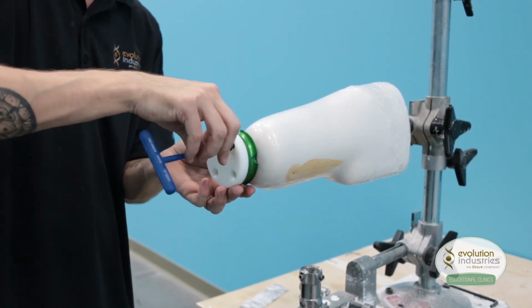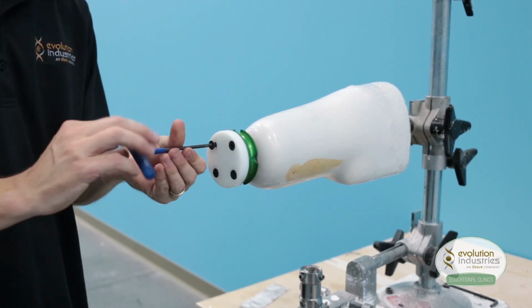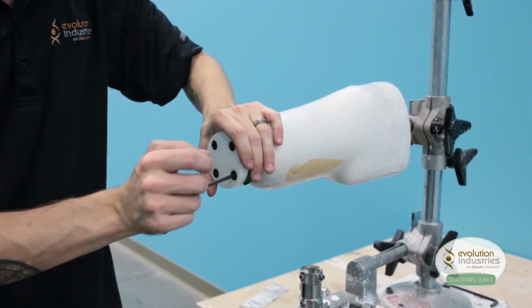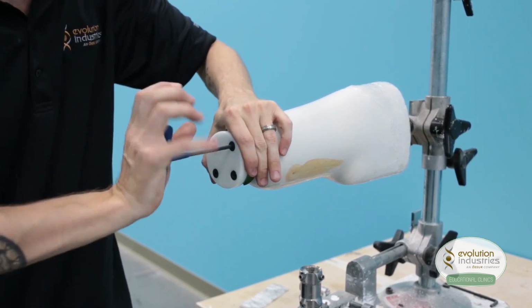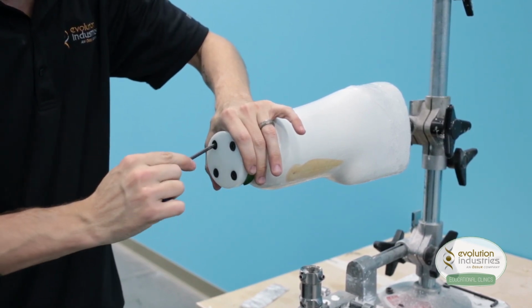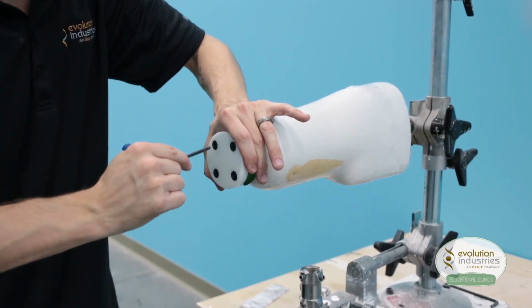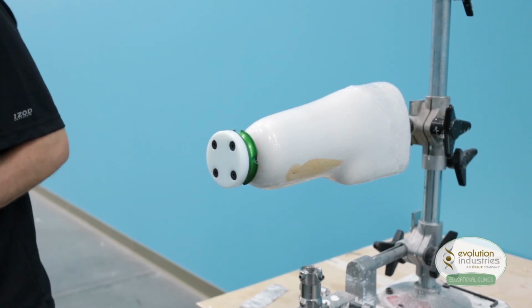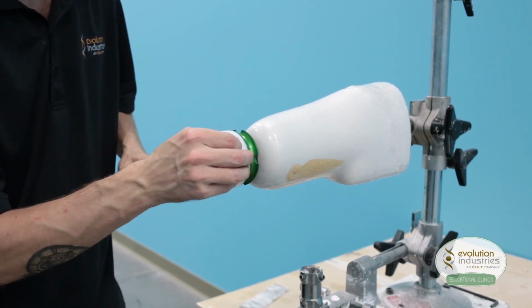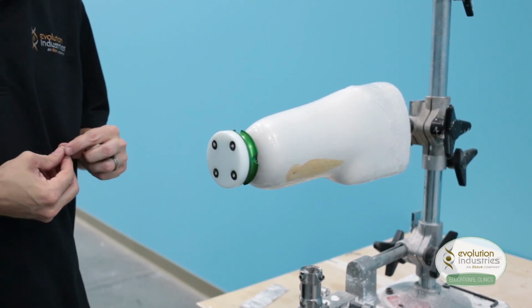With our lamination dummy, just use the same 4 set screws. And then you want to make sure that you screw them in, and that will prevent any resin leaking in underneath. Use a little bit more of your plumber's putty. You don't have to cover the entire screw, you just want to put some in the hole in the screw head. And we are ready for lamination.